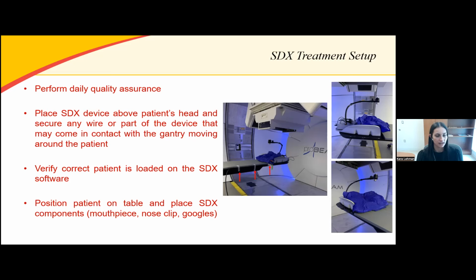So if the couch is kicked to different angles, it can become pretty tricky. So we really only do that in dosimetry if absolutely necessary. But the best piece of advice that I have is to try to keep your beam angles coplanar if at all possible.